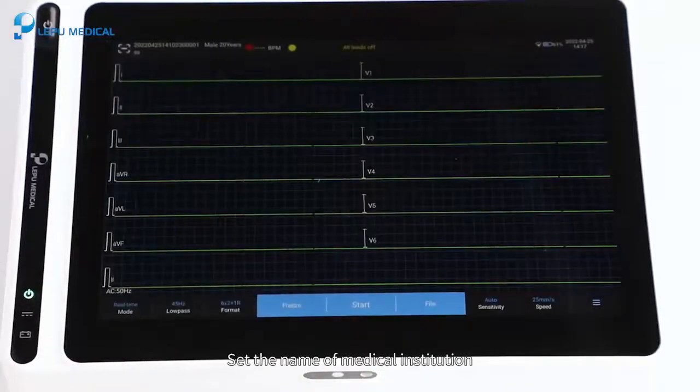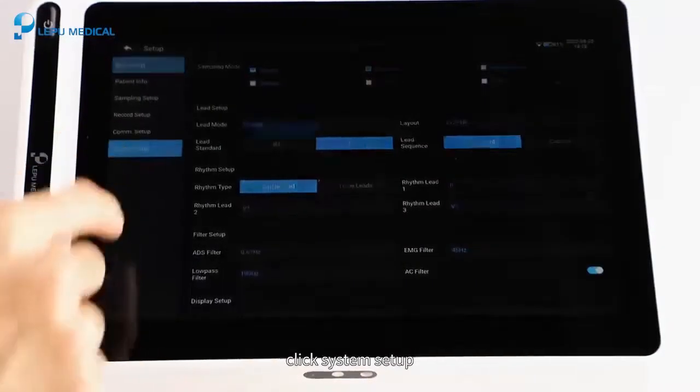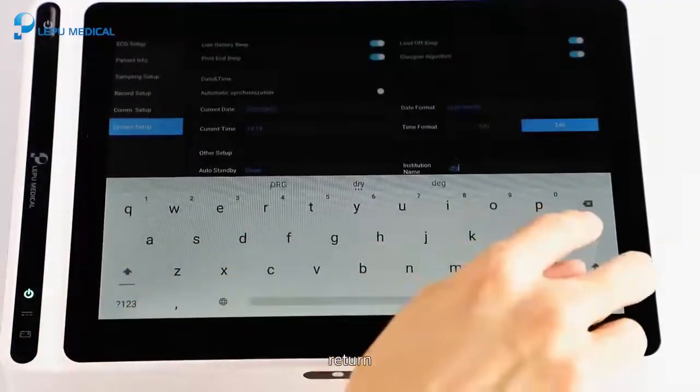Set the name of the medical institution. Click Setup. Click System Setup. Click Institution Name. Edit. Return.